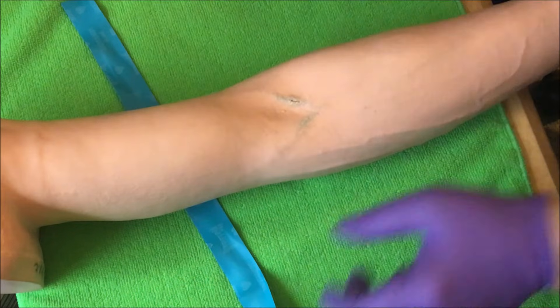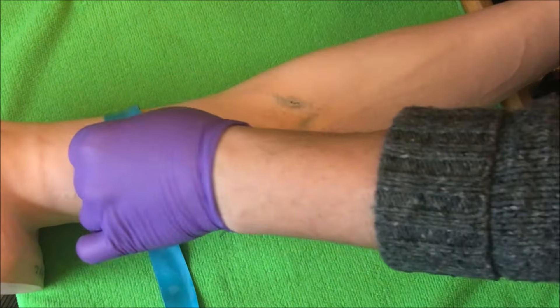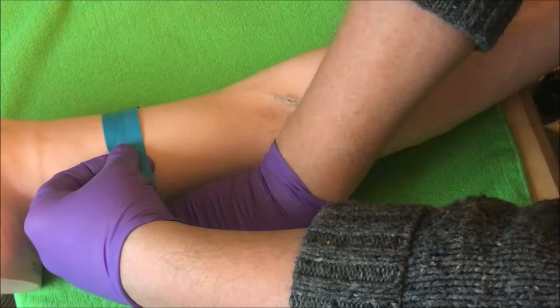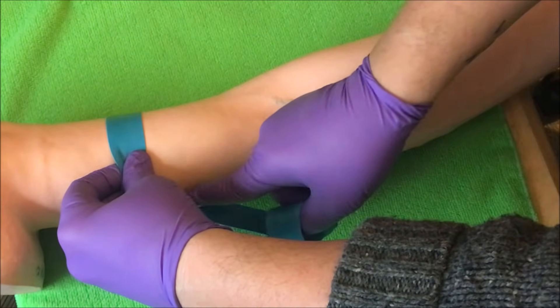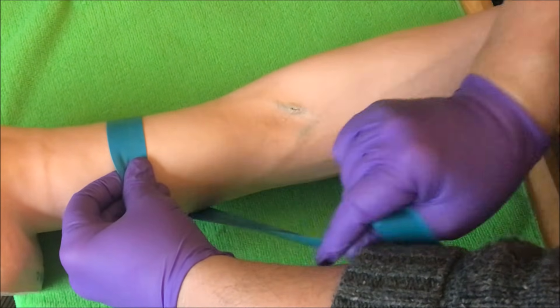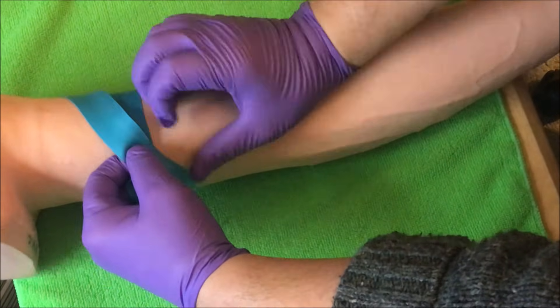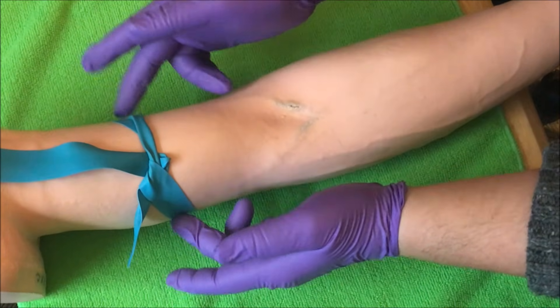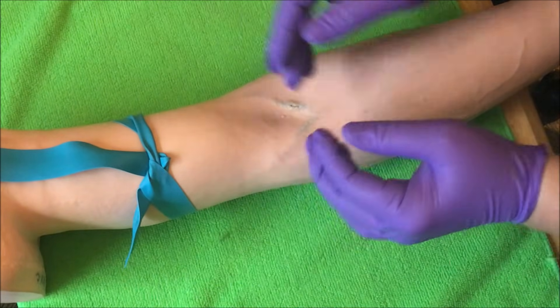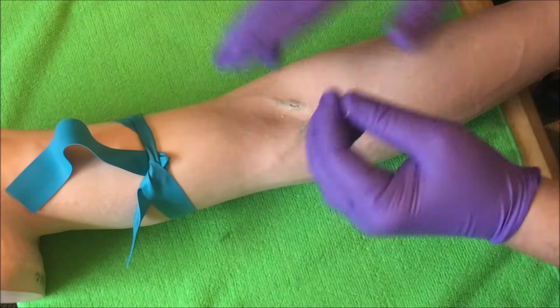Let's start again. Three to four inches above the site. If I'm right-handed, shorter piece on my right side, long piece over here. Two fingers and a thumb on this side, right hand goes underneath. I don't like to pull up toward the patient because I can roll the skin on the arm and also pinch some hairs. So I like to pull out, away from that, and once I get good tension I pull it over, clip it with my thumb, lift up, tuck — and there I go. The patient is more comfortable because it's not rolling on the skin and not pulling hair.